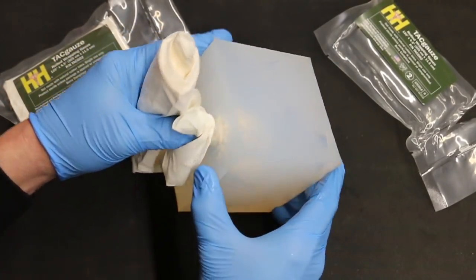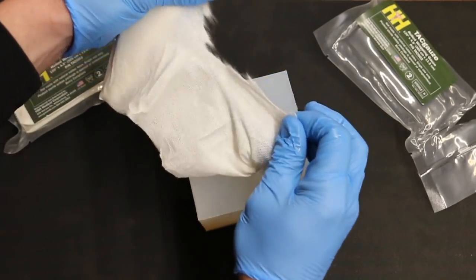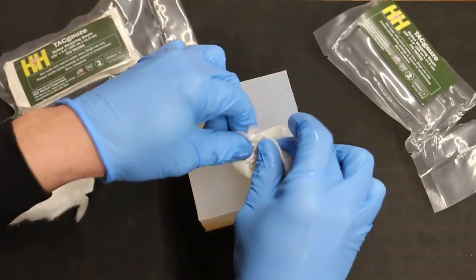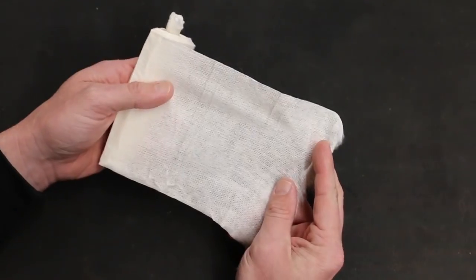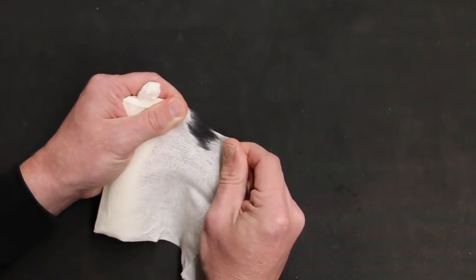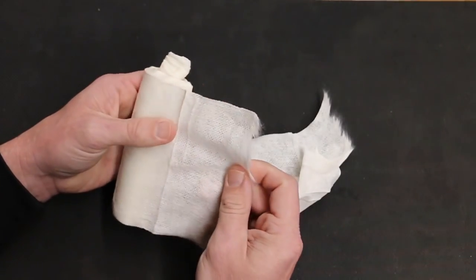Take the rest of it and we can tear it. Look how easy it tears. You can't typically just tear gauze with your bare hands like that — you can't. So that makes it super easy.